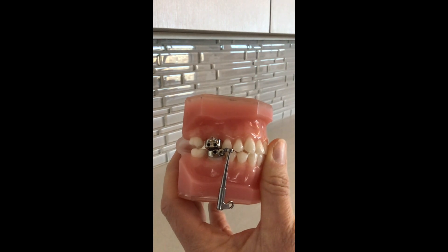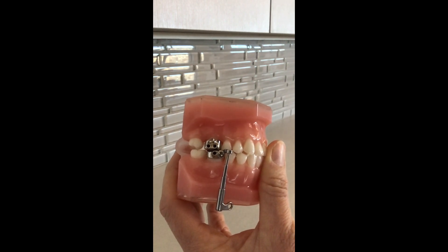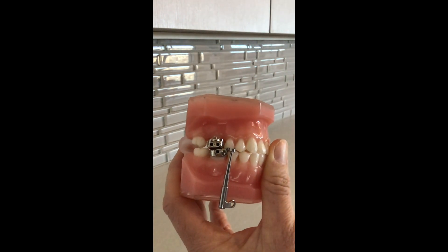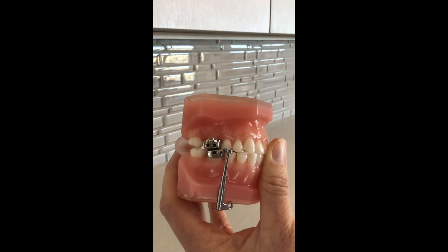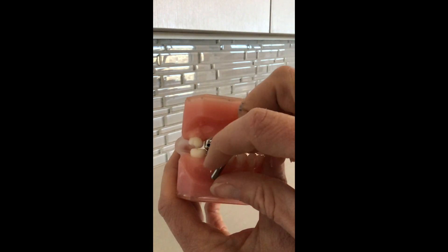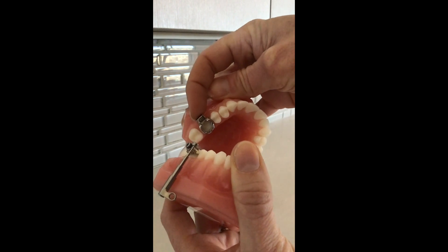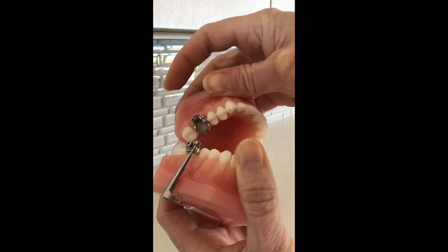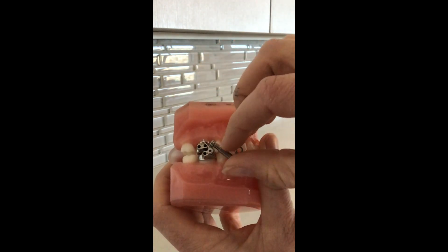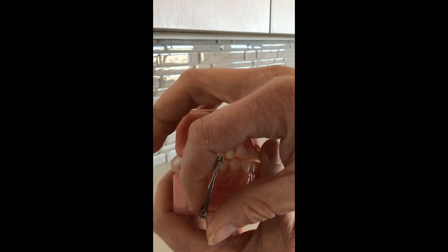Here's another potential, highly unlikely but possible situation that could happen. For those of you who have Herbst appliances in your mouth, some of them will look like this, some will look a little bit different. If you have a band, sometimes these bands can completely come loose from teeth occasionally, or if an arm of the Herbst does become loose on one side, it's probably not an emergency per se, but highly annoying.